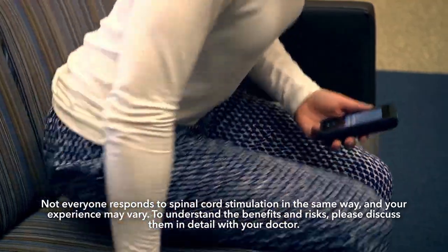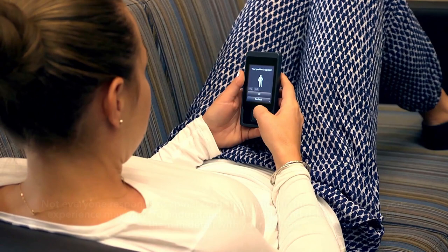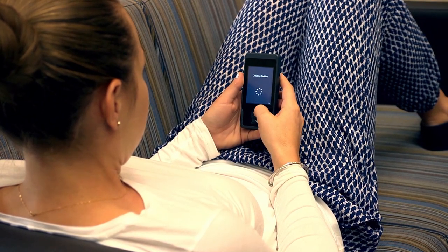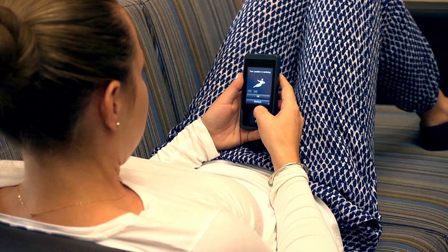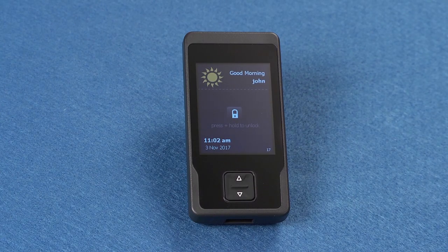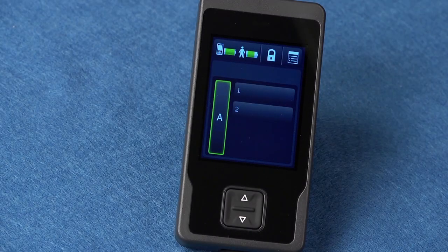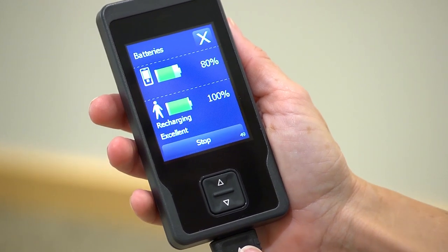After implant, you may want to adjust stimulation settings or turn your stimulation on or off. Adjusting stimulation is easy using your combined patient programmer and recharger. You can use the programmer to turn your stimulator on or off, check the battery charging status, adjust your stimulation settings and select programming groups, and connect to the recharger cord in order to recharge the programmer.